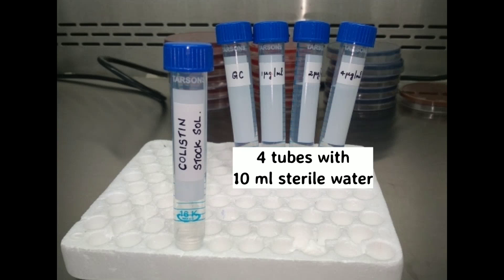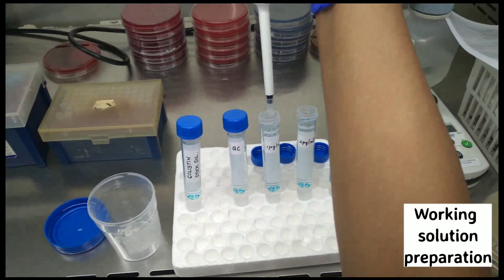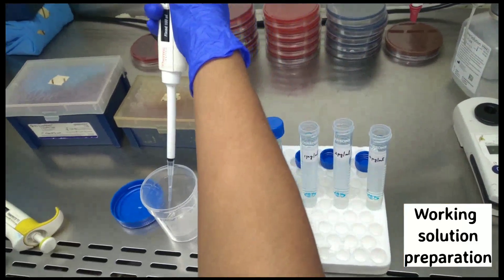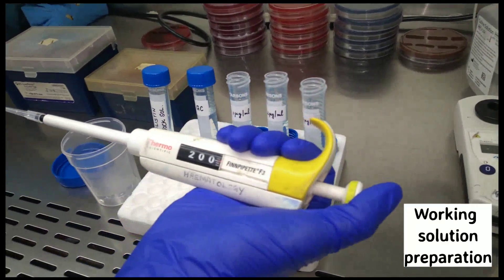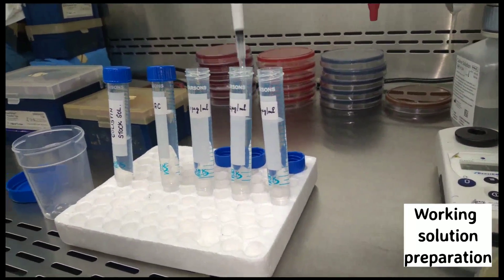Take four tubes of 10 ml sterile water, labeled as growth control, 1 microgram per ml, 2 microgram per ml, and 4 microgram per ml. From the 1 microgram per ml tube, remove 100 microlitres of sterile water. From the 2 microgram per ml tube, remove 200 microlitres of water.